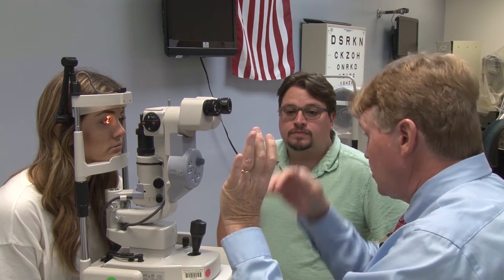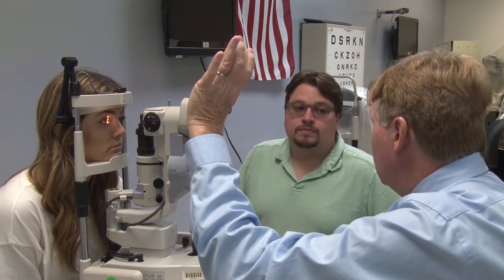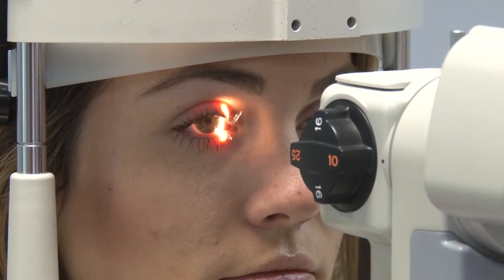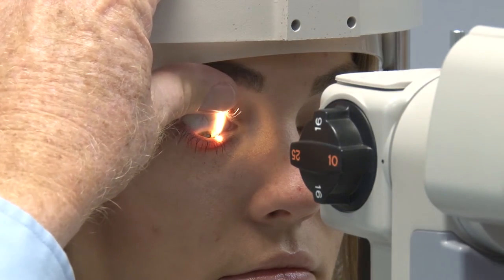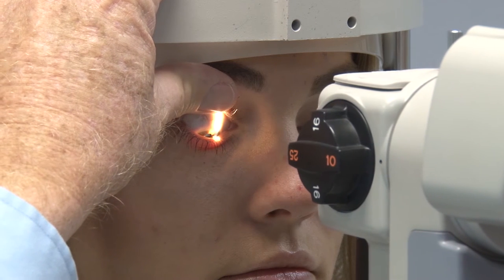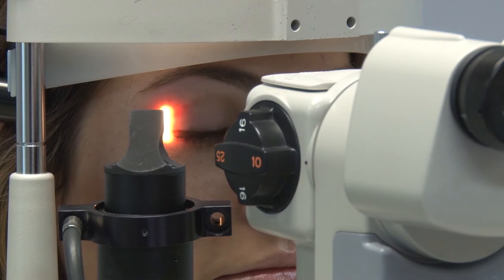Now I want to look at the upper bulbar conjunctiva. I'm going to use this part of my thumb, get underneath her lashes — she looks down — and I'll push her upper lid up to the orbital rim. That'll give me a nice view of the upper bulbar conjunctiva. I'm looking for signs of injection, and I'm also paying attention right at 12 o'clock to make sure there are no signs of neovascularization. Flip the light source over and continue across.